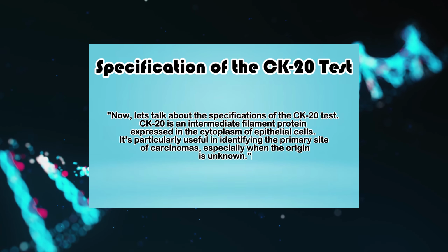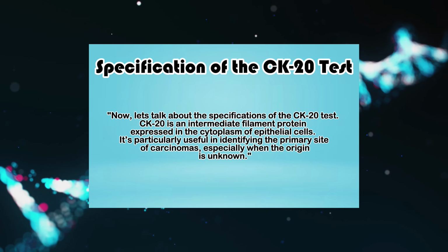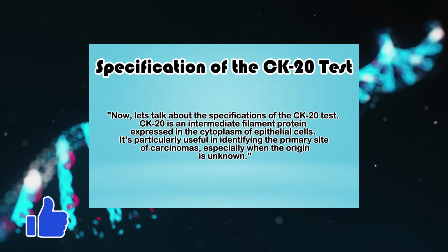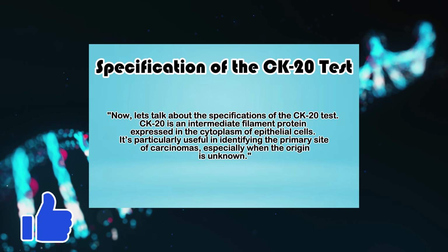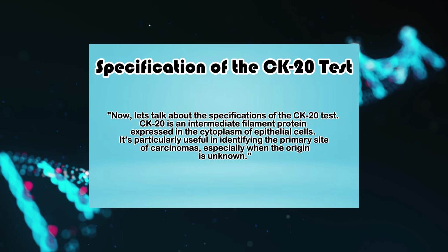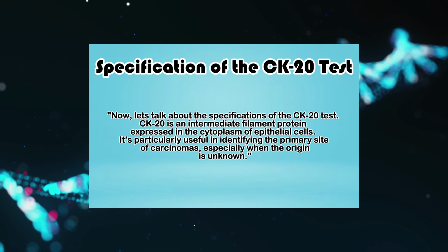Specification of the CK-20 test. Now, let's talk about the specifications of the CK-20 test. CK-20 is an intermediate filament protein expressed in the cytoplasm of epithelial cells. It's particularly useful in identifying the primary site of carcinomas, especially when the origin is unknown.